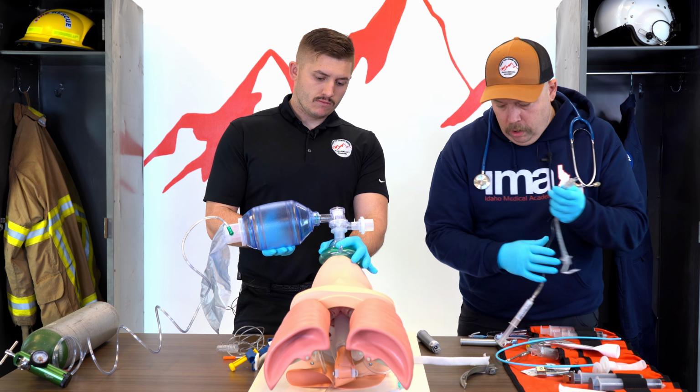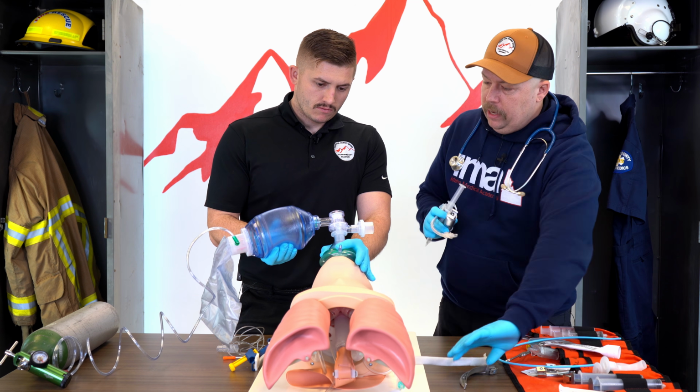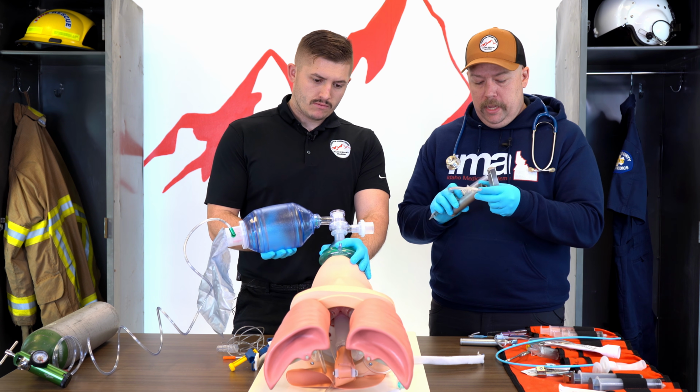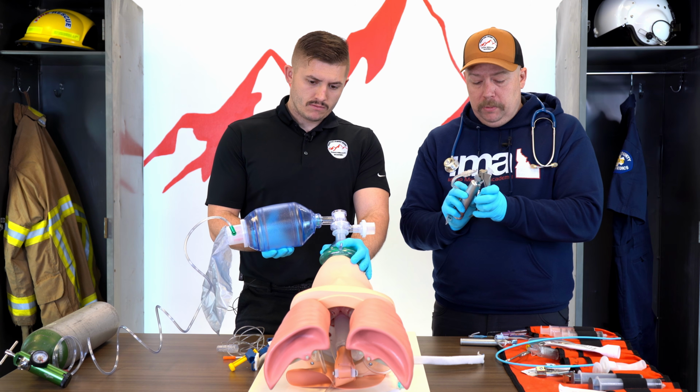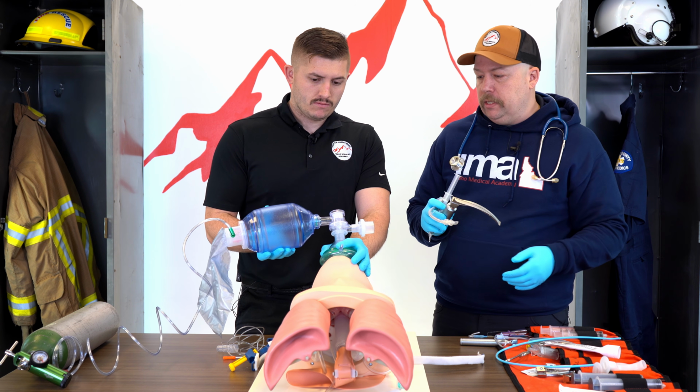All right, so we are always going to want to pre-oxygenate our patients and make sure we get some good breaths in beforehand. That doesn't necessarily mean their SpO2 is going to be high, but we will make sure that we are giving some breaths beforehand.